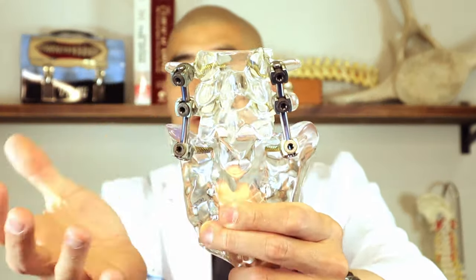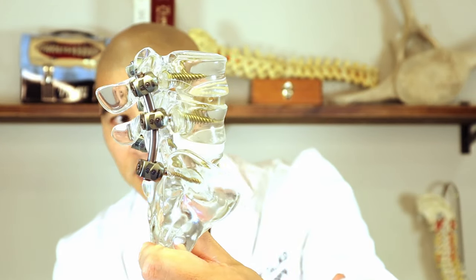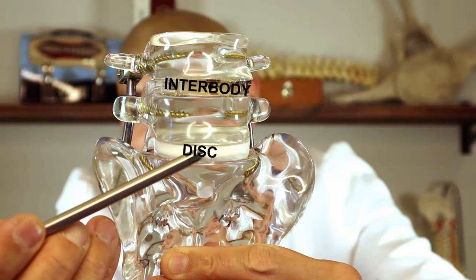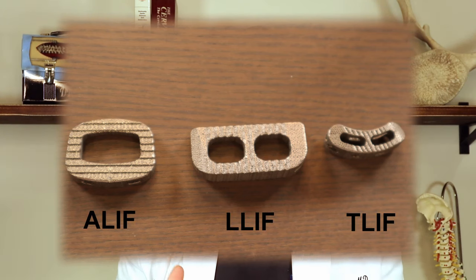As spine surgery has evolved, we've tried to make less invasive ways to do this and also to achieve higher fusion rates, because the surgery is only successful if the bones ultimately connect and grow together. The hardware is only there to hold the bone together so fusion can occur. It turns out a really good way to get bones to fuse better is to do something called an interbody fusion — 'inter' means between, 'body' is the vertebral body. You take the disc out, put a cage in between, and that cage is filled with a bone-growing substance so bone can grow through and across the cage.